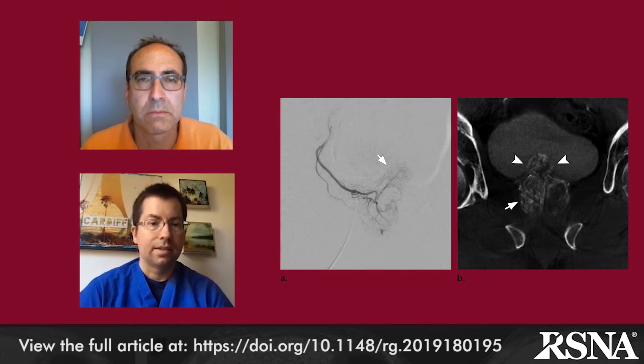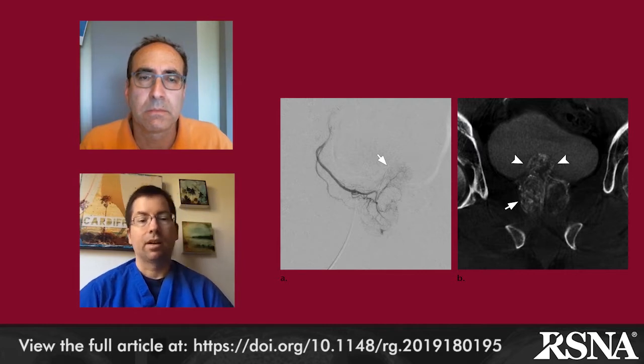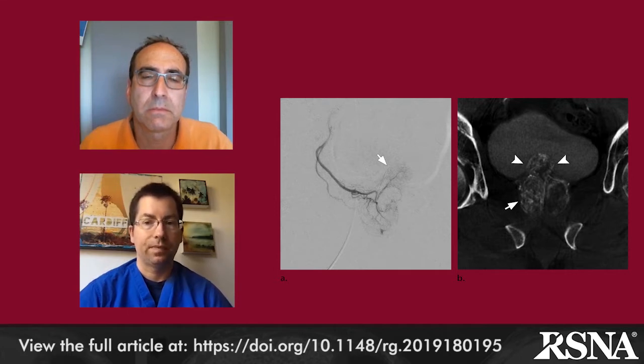This is done until near stasis is obtained in the vessel. At this point, the microcatheter is advanced distally as far as possible towards the prostate. Embolization is then performed from the distal position. It's been shown that with this technique, 30 to 50% more embolic material can be given. And Dr. Carnevale has demonstrated improved clinical outcomes compared to the conventional technique.